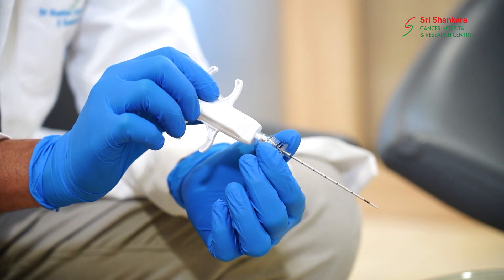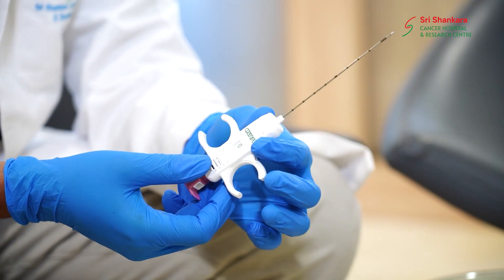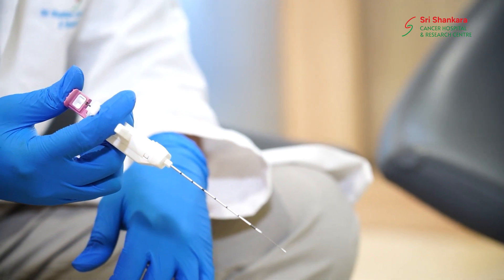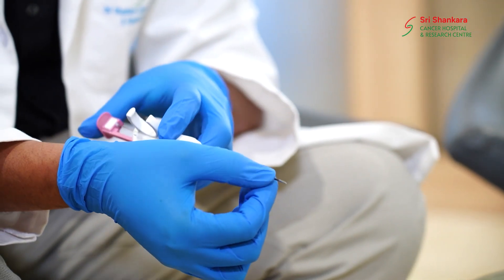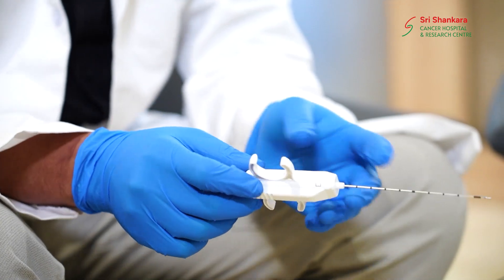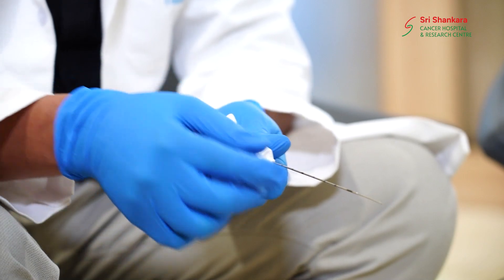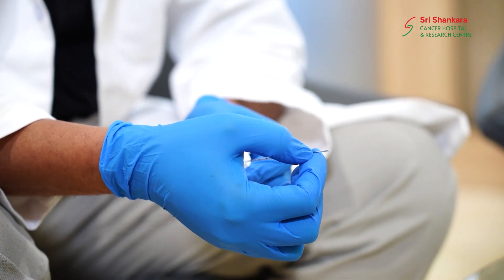I can pass this gun as many times as possible without pricking again and again. This semi-automatic biopsy gun has a spring inside. You push this trigger and it cuts. Once the tip is within the abnormal tissue and it is triggered, you will hear a snap sound. You should not be afraid — when you hear the snap sound, it is perfectly okay. It is just that the biopsy gun is doing its job. It will cut a thin strip of tissue which will lodge inside this wedge, and that tissue will be sent to the pathologist.